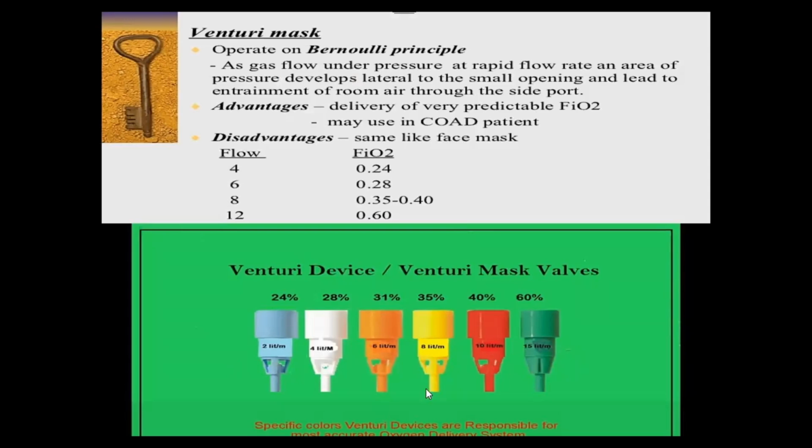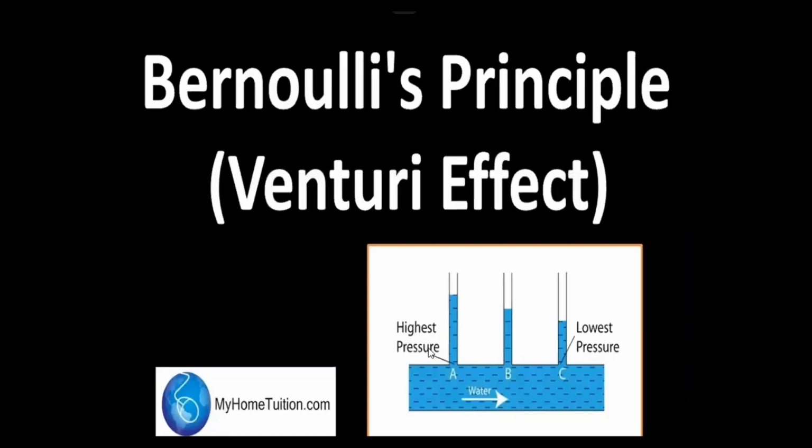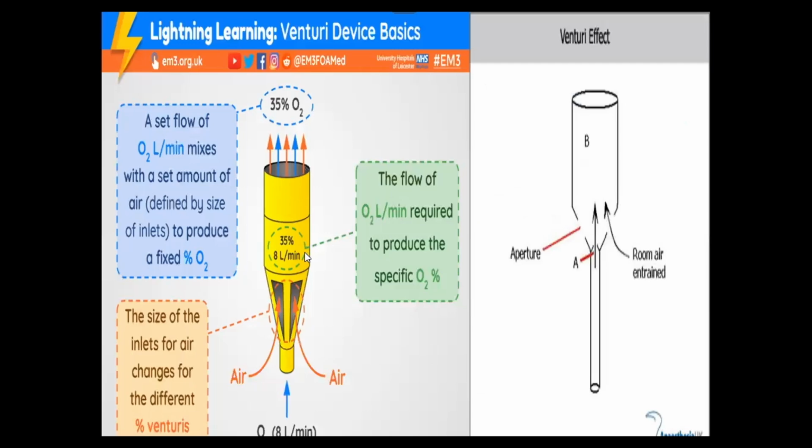But I think the one we have, 60% is red color, 40% is pink color, in our hospital HSA. This can change from company to company. This is not universal. Okay, so that's why you always have to check the adapter.